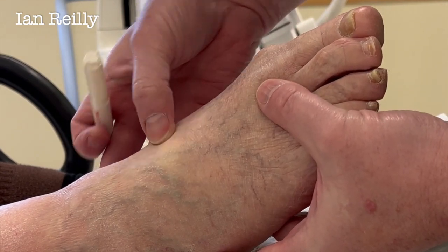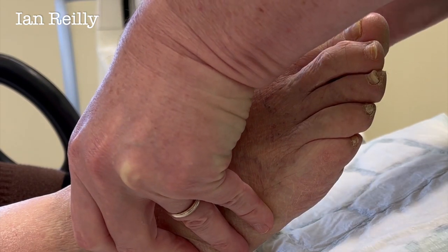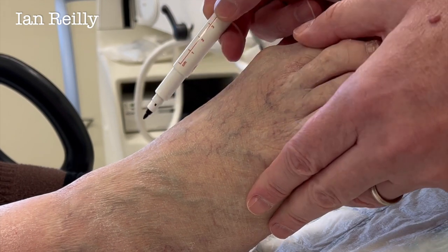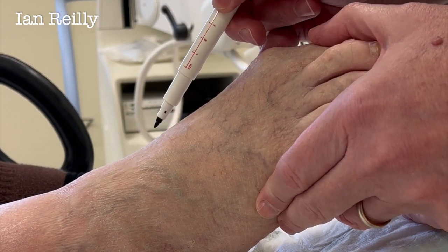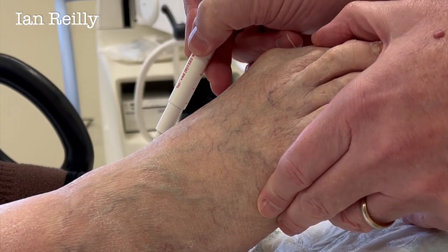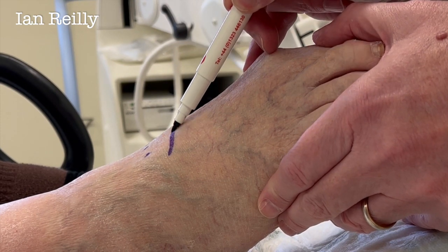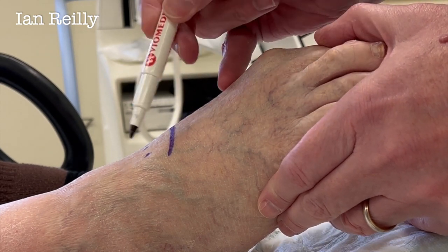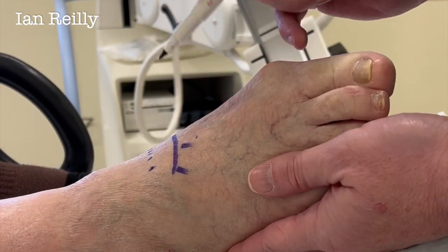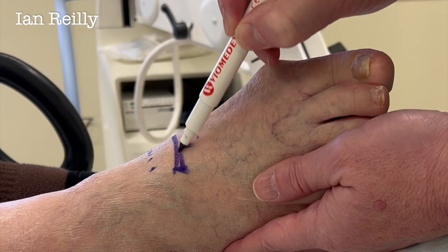Your pain's about here, isn't it? So let's just mark up somewhere on the top. Yeah, that hurts as well. Viewers, you can't see on the camera, but there's the high point of the navicular. The talonavicular joint is coming around at this point here — here's your navicular. So where we're really interested is the navicular cuneiform joints. There's a little bit of arthritis on the inside but it's more on the top — the pain isn't it?